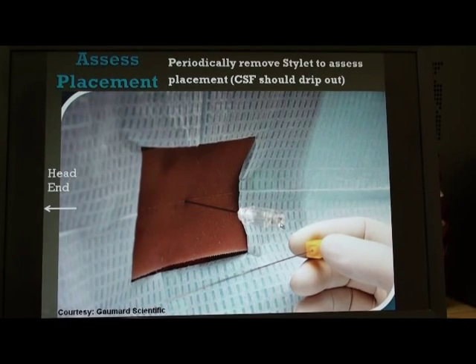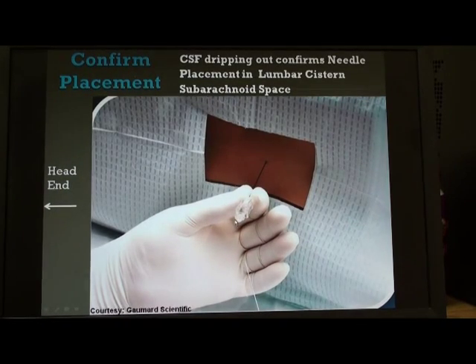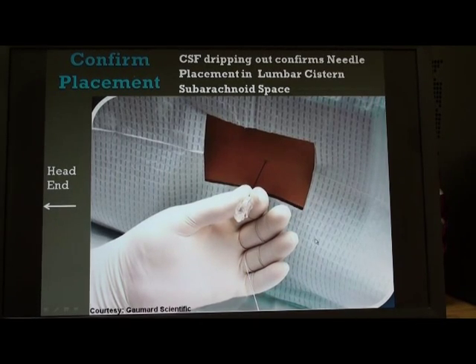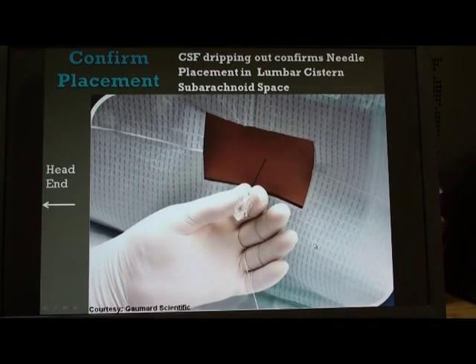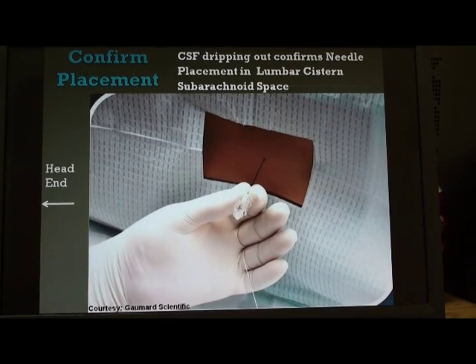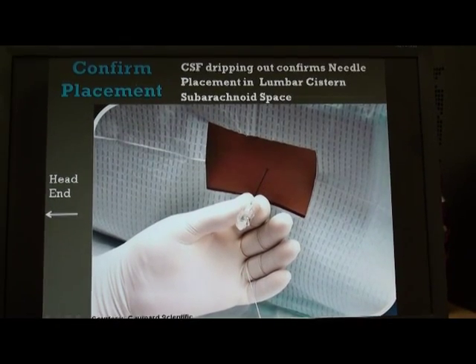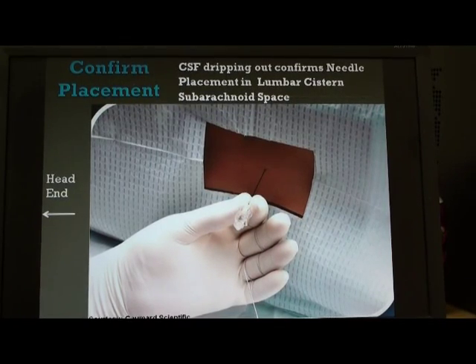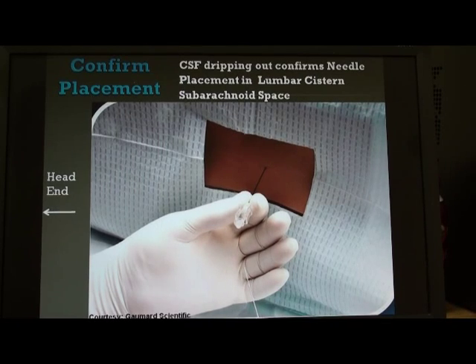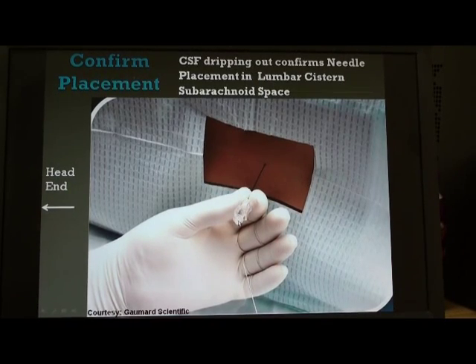Periodically, we remove the stilette to see CSF dripping out, as seen in this next slide. We can see the simulated CSF dripping out. In an actual situation, if CSF does not drip, there are maneuvers we can try: ask the patient to cough gently, which can bring CSF out; or gently rotate the hub of the needle along its own axis without moving it forward or backward, which can dislodge a small filament of arachnoid trabeculae blocking the needle.